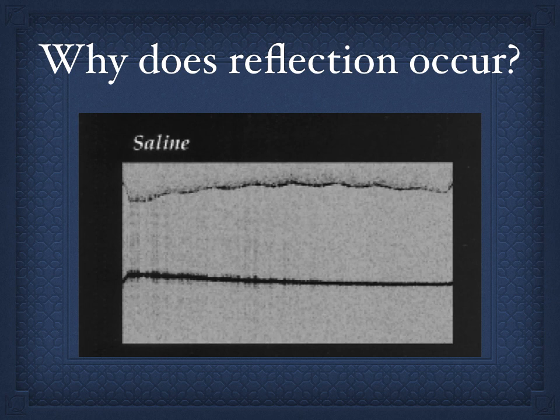So what does cause reflection? It's actually several things that are key in reflecting the signal back, but there's one critical component. Again, this is the same image as the top of the last figure. The top is the saline surface and the bottom is the image. This is a droplet, that's why the surface is a little bit curved. Above the water is air, and then the second reflection is a metal reflection.